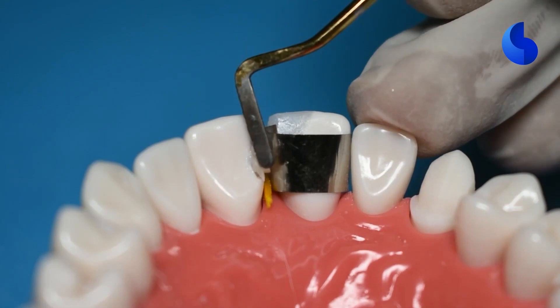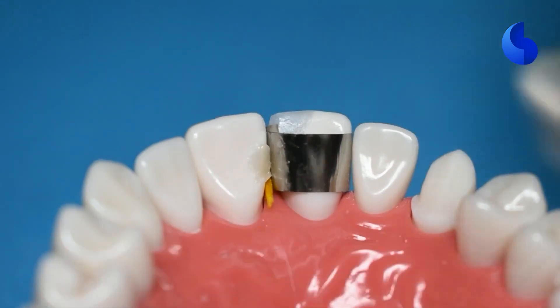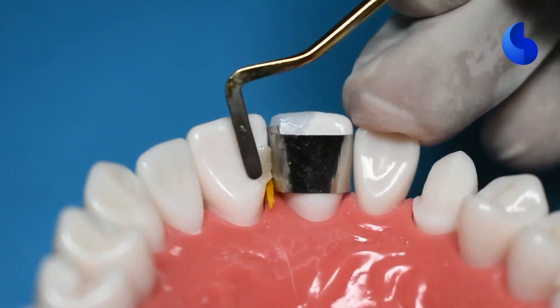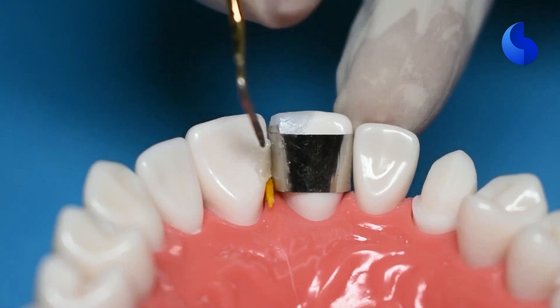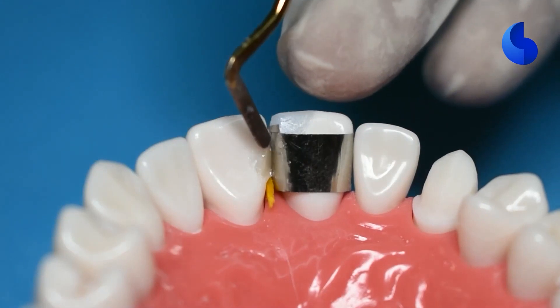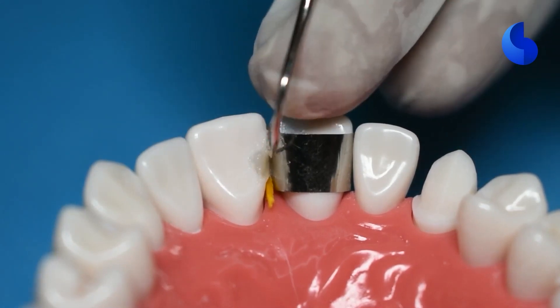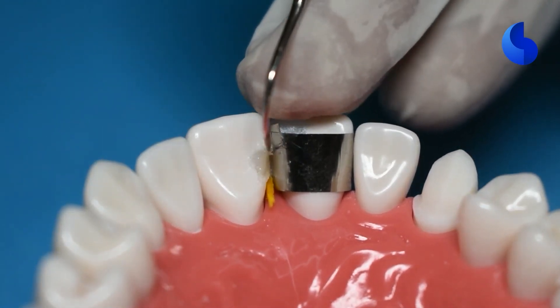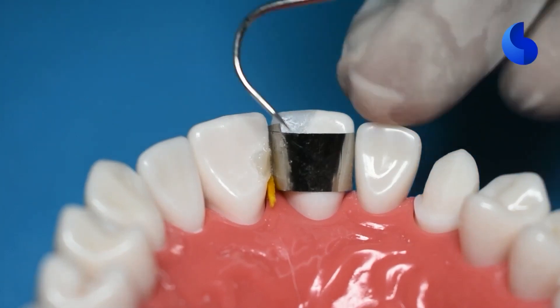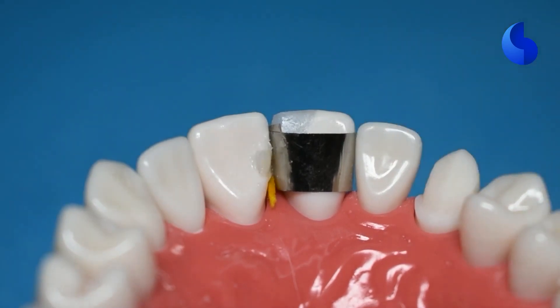Once we've ensured that this is completely cured, we can go ahead and start adding the additional layer of composite. And like we said, a little goes a long way. Just a little bit of composite, and many times we may not be able to take the composite gun and orient it in a way that we want to add composite to these class 3 cavities. So a good way to do that is to take some composite in your plastic instrument and carry it to the cavity. And then use an explorer to remove excess so it makes your job easier when you go ahead to finish this restoration.